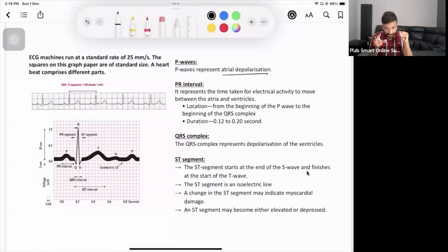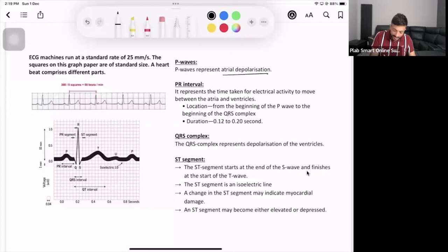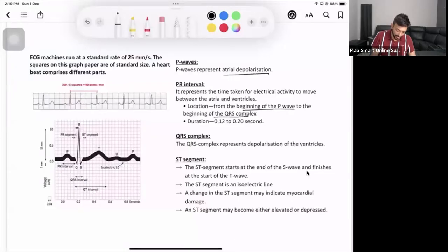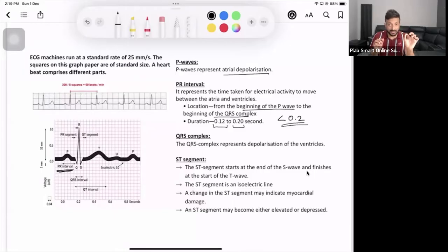The PR interval runs from the beginning of the P wave to the beginning of the QRS complex. It represents the time taken for electrical activity to travel from the atria. The PR interval should be less than 0.2 seconds.